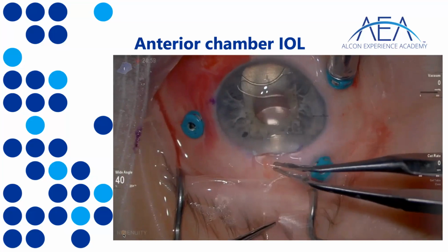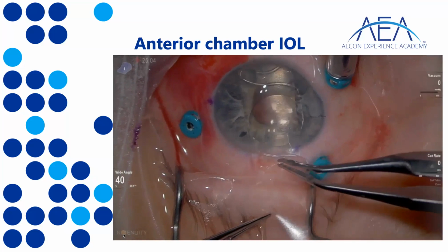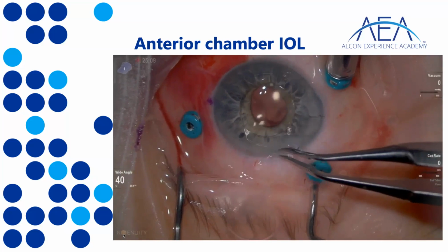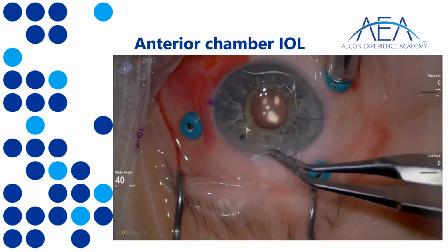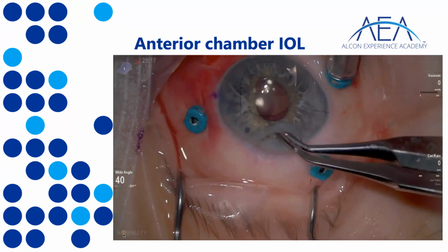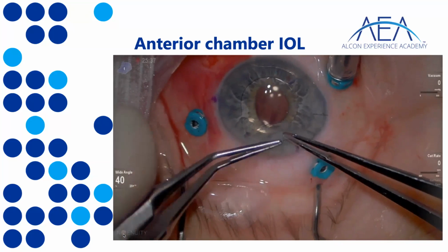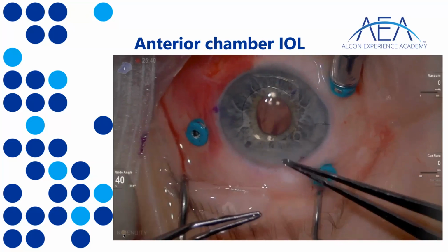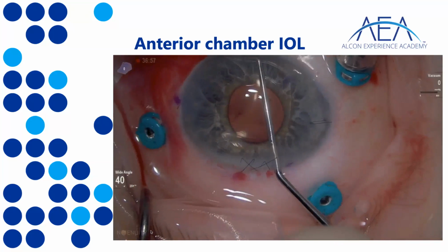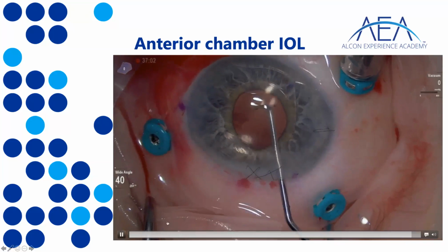Once the lens is inside the eye, the slide can easily be removed. The lens stays in place, as you will see in a second, and the distal part, the peripheral part of the lens, is inserted inside the eye in the iridocorneal space. The whole surgery ends up with a couple of sutures because we have to create a usually 5.5 mm cut on the cornea.